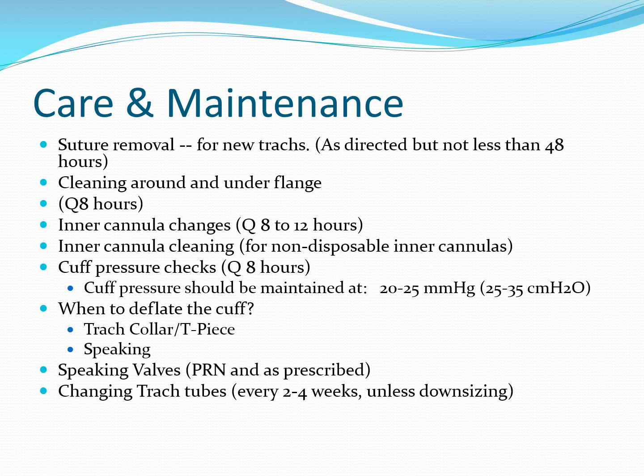When to deflate the cuff is really important to remember, and to remind your staff: if the patient is spontaneously breathing, the cuff should generally be deflated. There are rare exceptions. At the acute care facility where I work, we have an active head and neck cancer program. For individuals who have had, let's say, a neck resection because of a malignancy or other condition, we typically will keep the cuff inflated despite the patient spontaneously breathing.